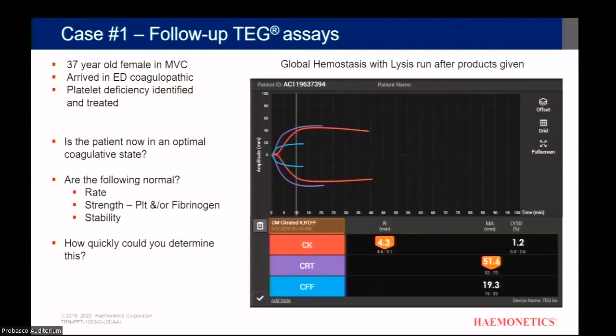We will also, so it's in addition to, right? For platelet mapping, it's just a separate cartridge of the 4 tests that make up platelet mapping. Does that make sense? And we're building an order in Epic that will include both of them. Checking boxes is kind of menial, but there will be one that includes both, and there will also be a la carte options for you. If you don't want to run platelet mapping, or if you just want to run platelet mapping but you don't care so much about lysis. Other questions?